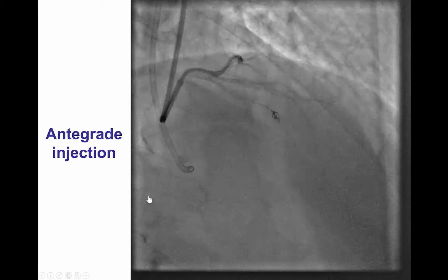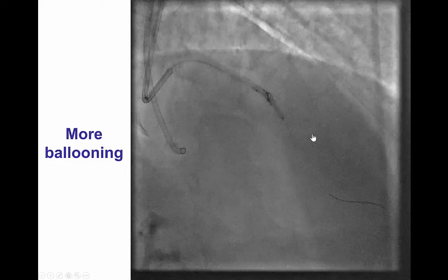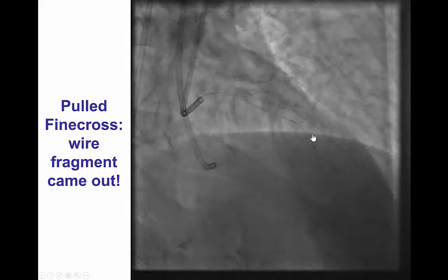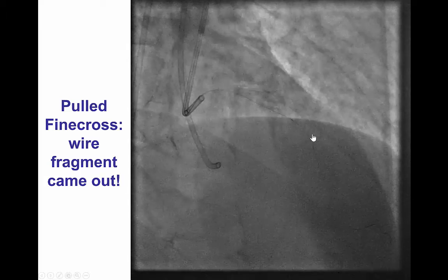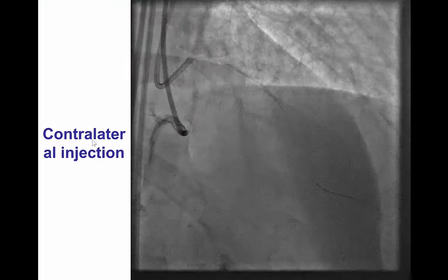After ballooning there was some antegrade flow; however, the fractured guidewire still remained. We did some more ballooning and then eventually pulled the Finecross, and to our surprise the entire system including the Finecross microcatheter and the entangled guidewire came out. This is the probably unraveled distal part of the coil of the Fielder LXT guidewire, fairly dismantled with pieces of polymer in different parts of the guidewire. It was a fortunate event that the entire guidewire fragment came out instead of getting entangled in the vessel and potentially prolapsing into the aorta, which could be a major complication.